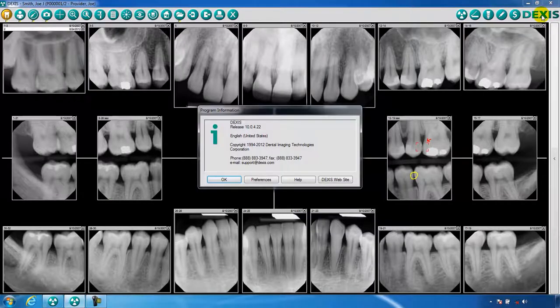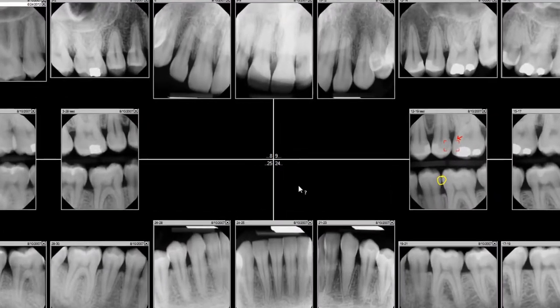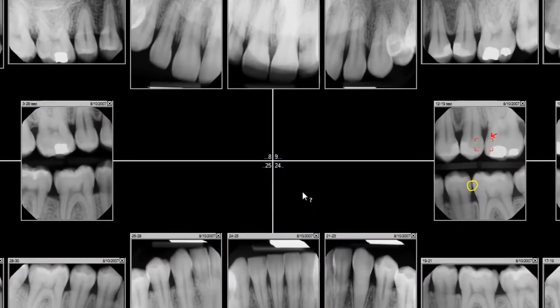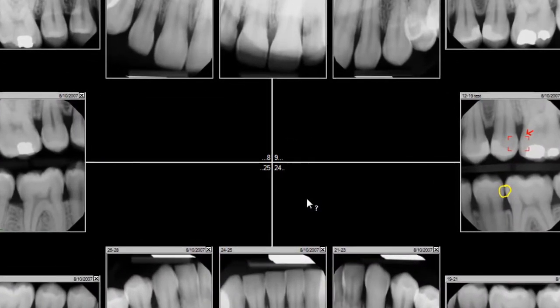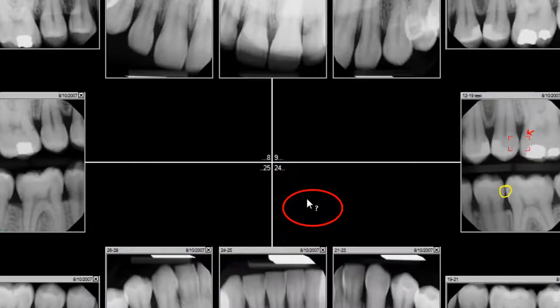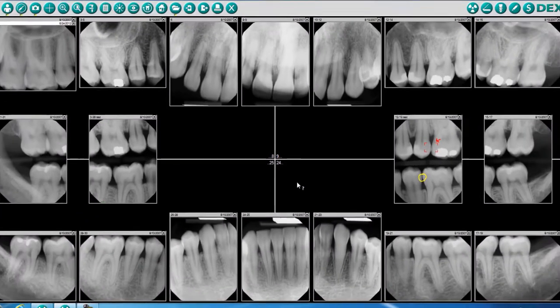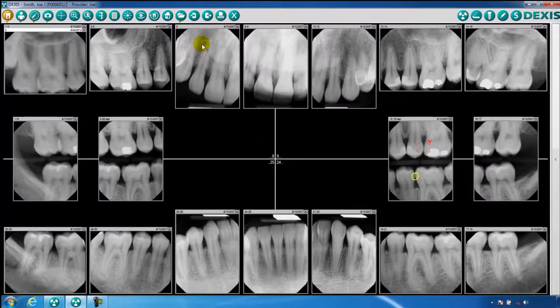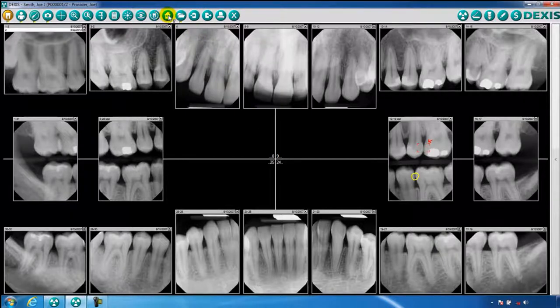By clicking on the DEXIS logo, you will open a window which will display the program information and give you the option to access the on-screen manual by clicking on the help function. When the help button is clicked, an associated question mark will appear on the cursor. When you click on the area that you would like help with or have a question about, the DEXIS manual will open to that corresponding page.